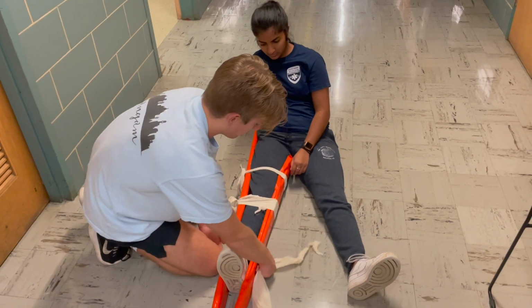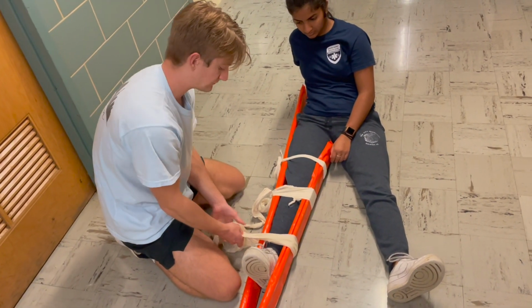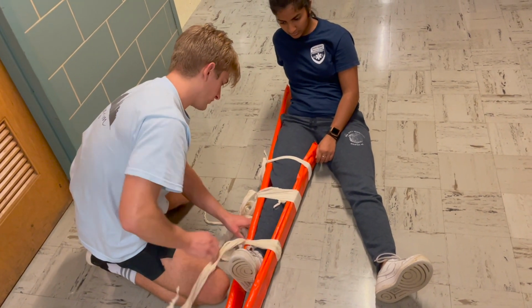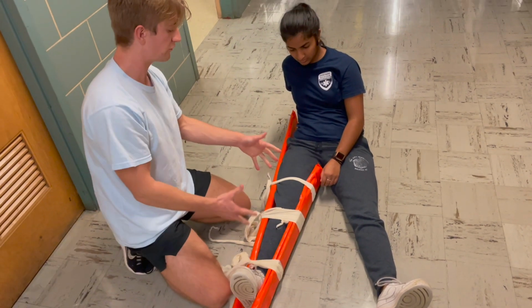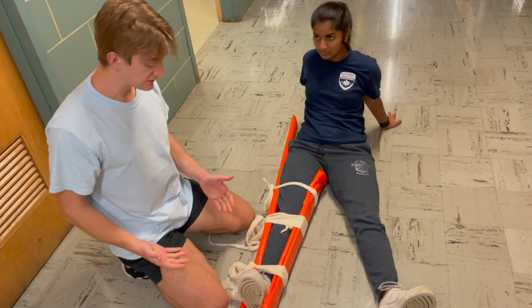And then here, I'll do 1 more tie below the injury. Again, tying really tightly because we don't want the patient's leg to be able to move at all during transport. So that's basically the entire skill.